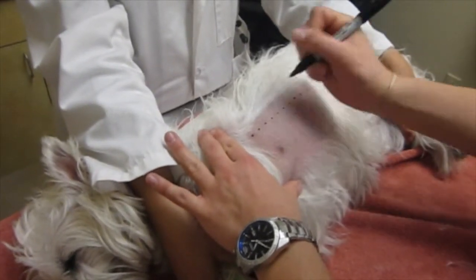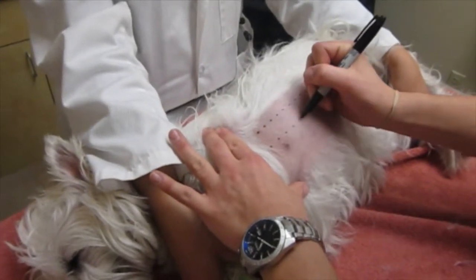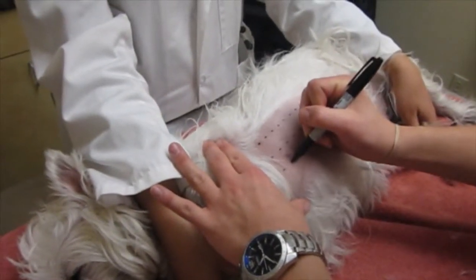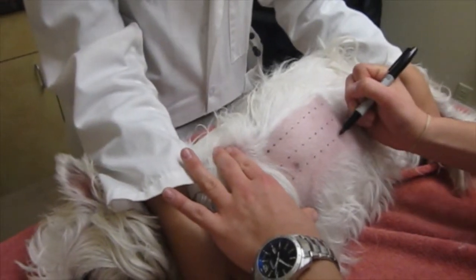The Sharpie comes off pretty easily. This is so that we can keep track of the 67 different injections that we do. Each one is right into the skin, and once we have the pattern down, we'll start injections.